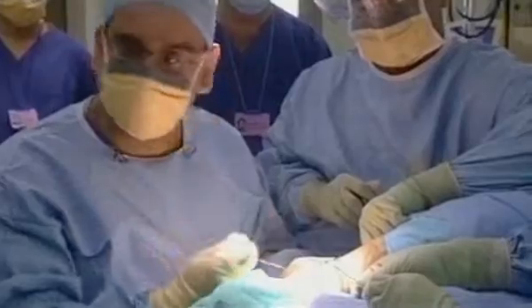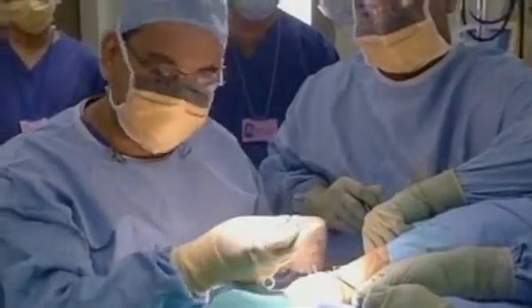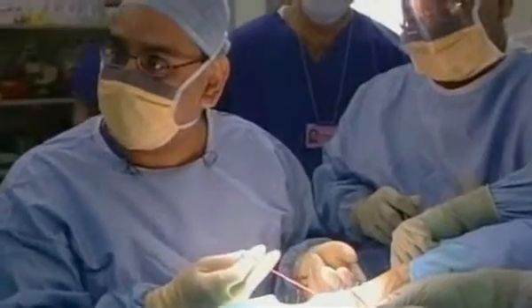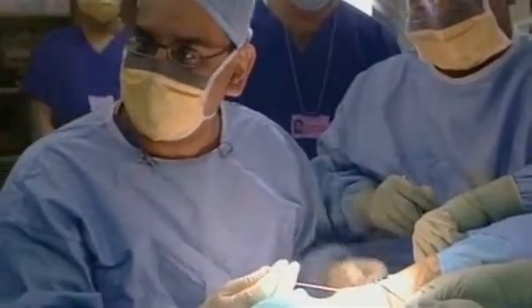This is like a rubber band. It's called a vascular sling, and it's just nice for us to show things and for keeping the tendon safe. It's marked in red. We know we need to watch out for it, for danger. Yeah, so we don't damage the tendon.